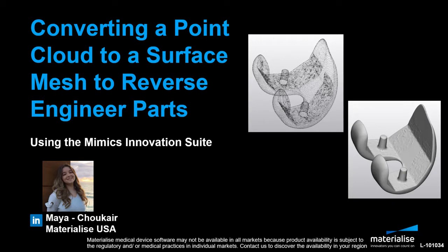In this video, I'll show you how easy it can be to convert a point cloud file, like the one here, to a surface mesh that you can then manipulate, design off of, analyze, 3D print, and more. This is especially helpful if, for example, you have a physical device or a part that you'd like to work off of virtually in 3matic.